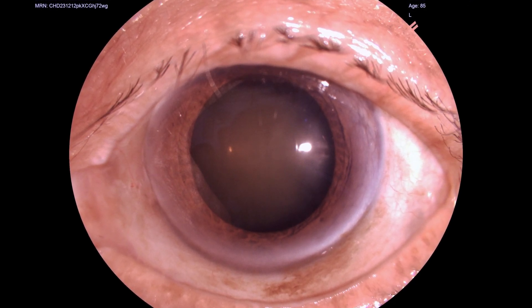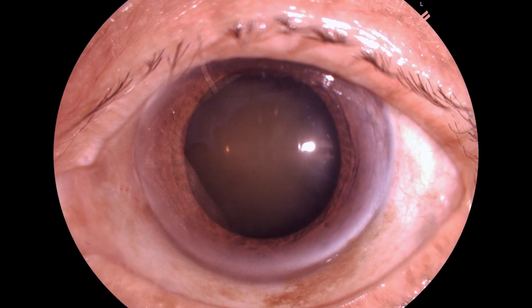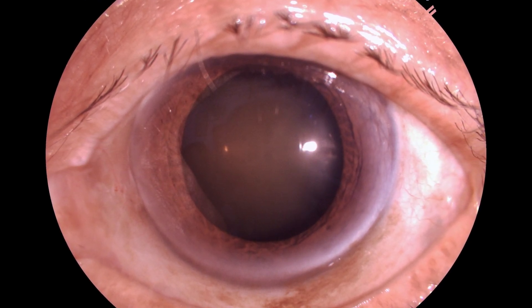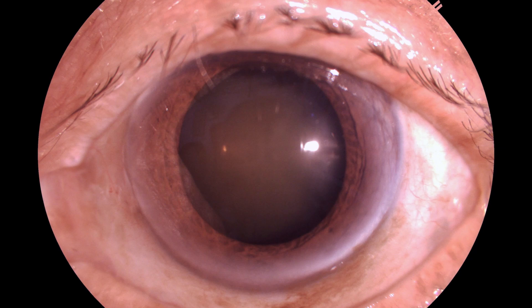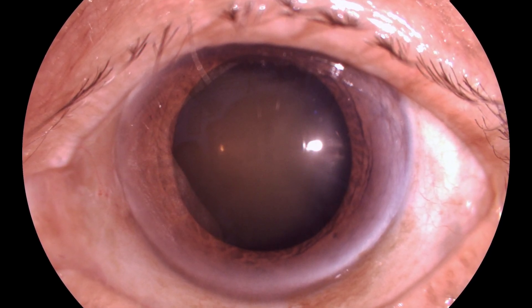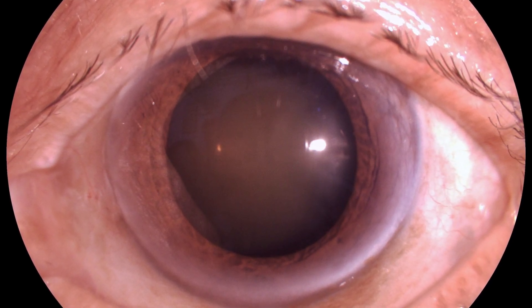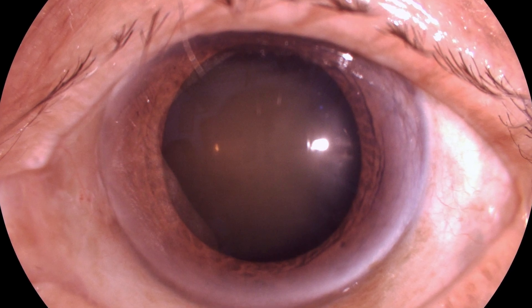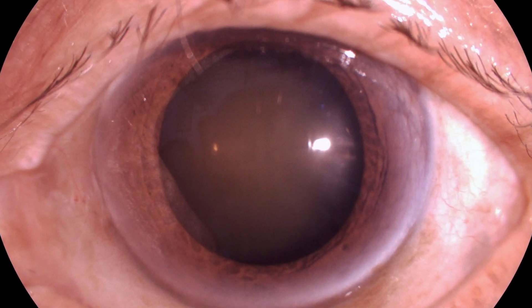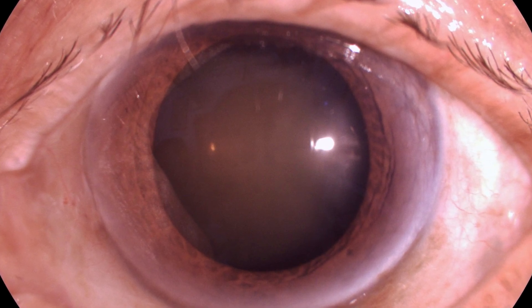In present times, phacoemulsification is the choice of surgery for removal of cataract, and the reason is that it has so many advantages and the patients are more comfortable with it. However, the only concern is that patients who have hard cataract may have loss of endothelial cells, and that becomes one relative contraindication.